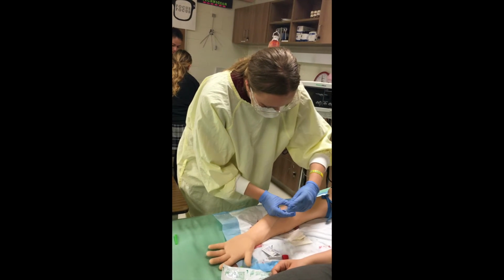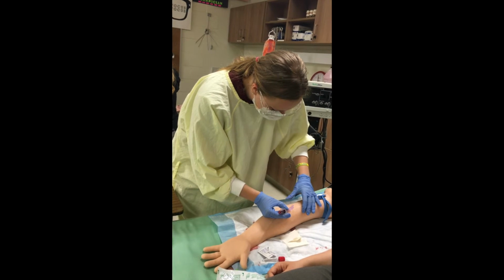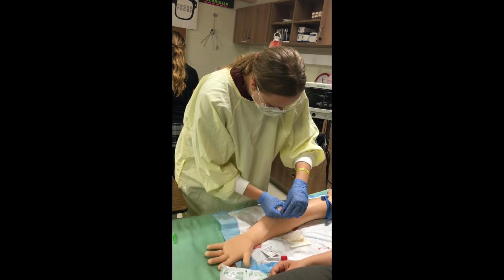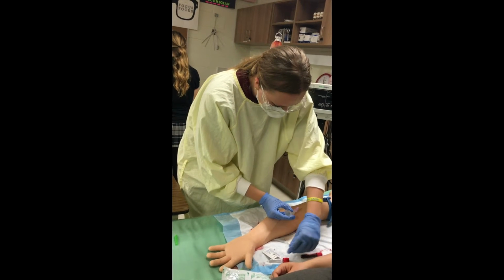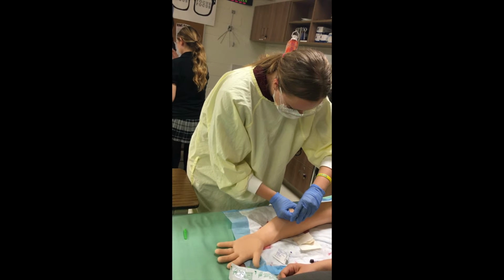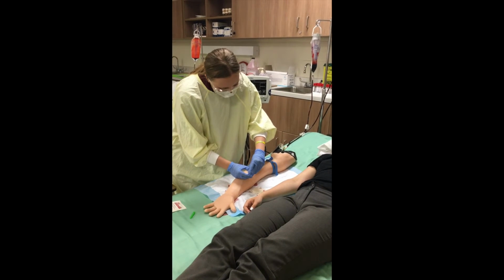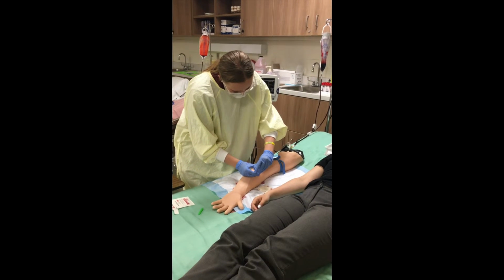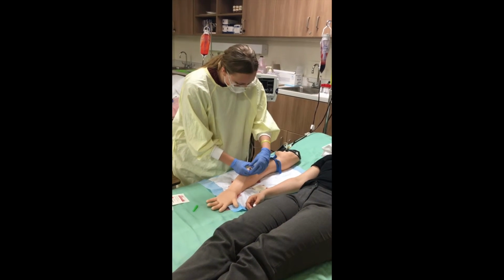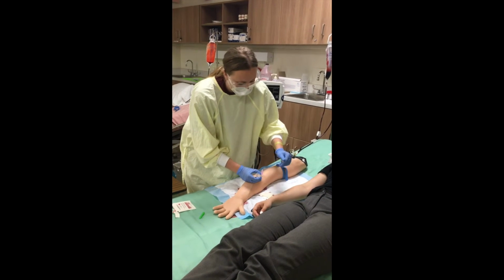I'm going to grab my blood collection tube and place it in the vacuum, and then take it out. I have another one. It's a suction, so it should come out right away. Okay, so I'm gonna put the blood collection tube inside, and it's a vacuum, so the blood will come out right away. And once it's done, you can just take it out and put it beside you.